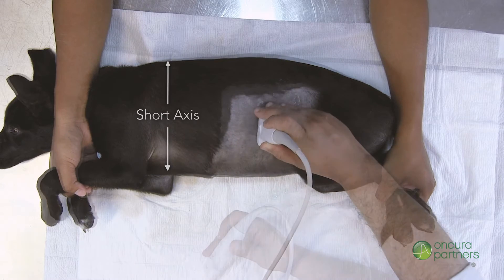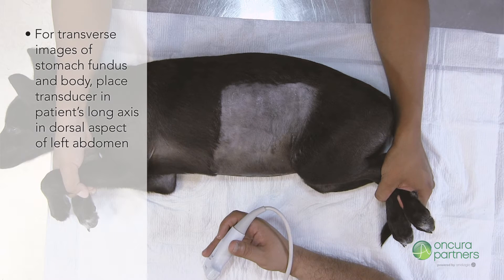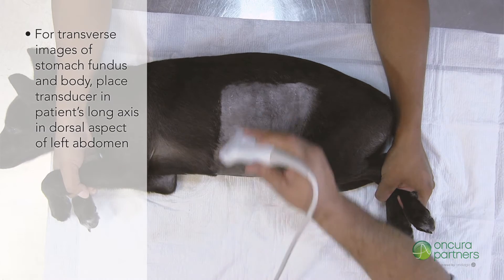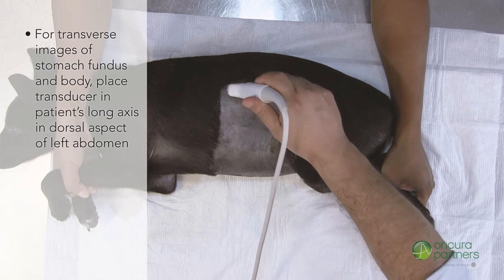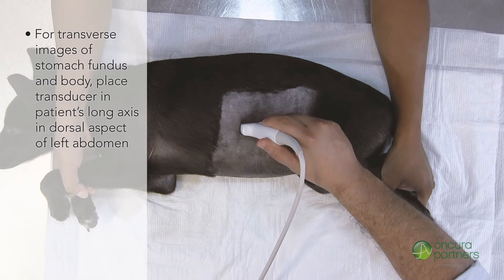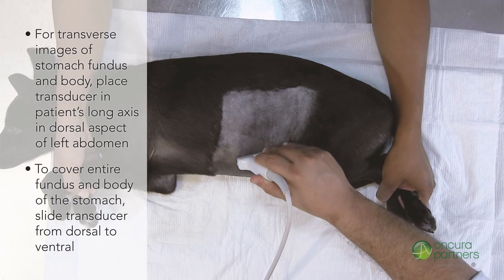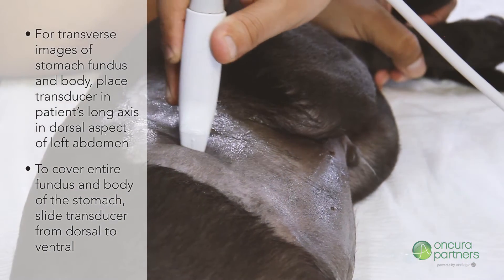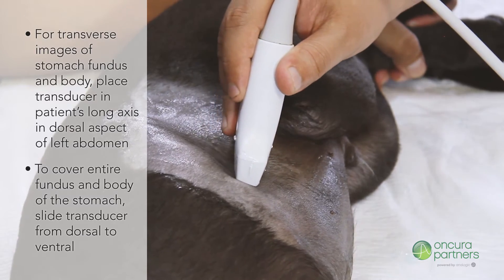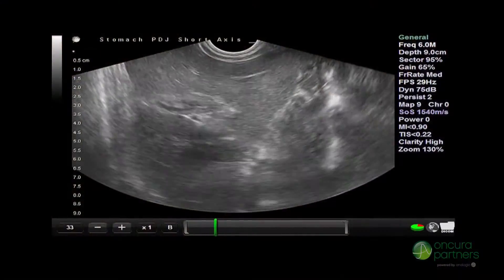To acquire transverse images of the fundus and body of the stomach, place the transducer in the patient's long axis in the dorsal aspect of the left abdomen. To cover the entire fundus and stomach body, slide the transducer from dorsal to ventral using the appropriate depth.